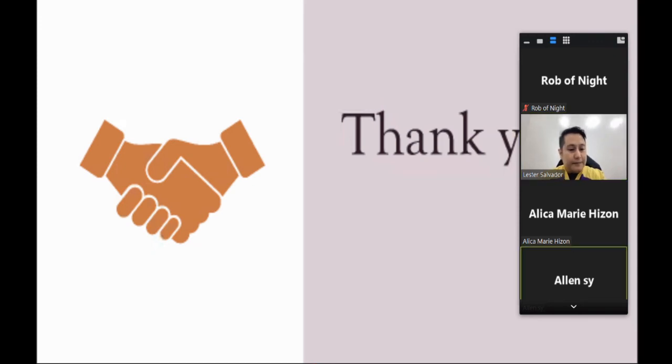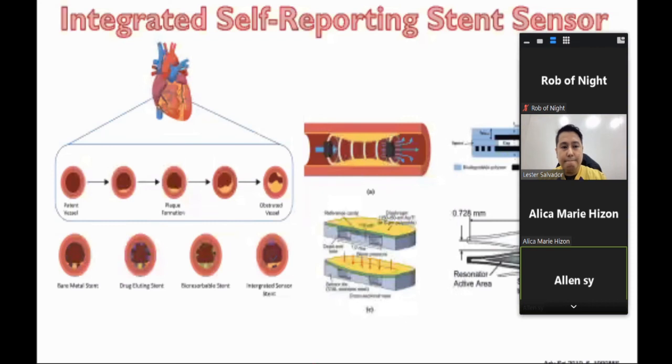So I think this is important. This is the main difference of the stent companies, mainly their stent morphologies. This is one of their selling points, giving them additional benefits or comparing them to others. Of course, thinner struts could be better, but not too thin that they fracture. And some stent designs are easier to handle, for example, bifurcation stenting, as compared to those closed cell designs.